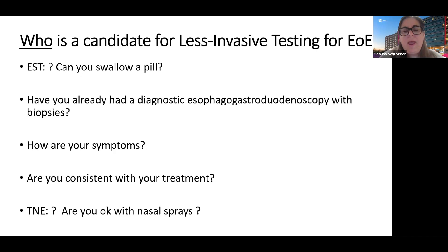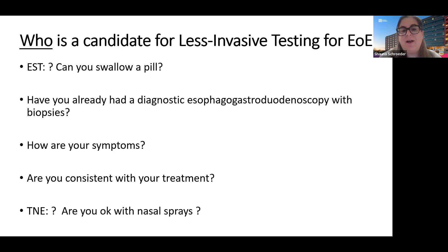Specifically for the TNE, the major question I ask patients is, can you tolerate nasal sprays? If you can allow me near your nose at age eight or nine and you could be distracted with VR goggles, it's just a matter of letting me spend five minutes in your nose. I recently had one of my colleagues perform a transnasal endoscopy on me. I found that the lidocaine was the most difficult part — it was bitter — but I often use a candy spray to mask that taste. As far as tolerating passage through the nose or back down the throat, it really was minimally discomforting and well tolerated by both adults and pediatric patients.